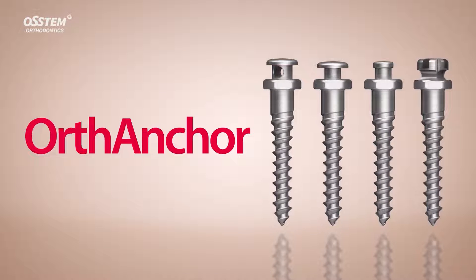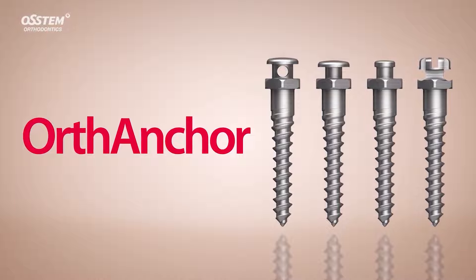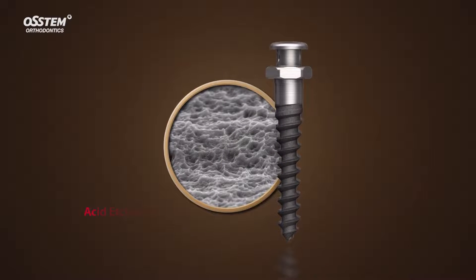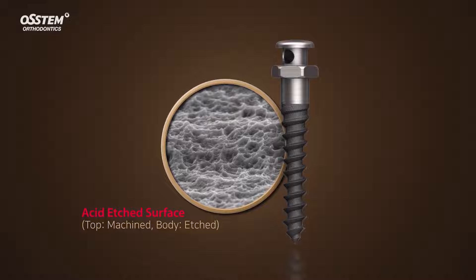Introducing the OrthAnchor. The OrthAnchor is an orthodontic screw made by Austin. It has three notable features. Two different types of OrthAnchors are currently available: a machine surface and an acid etched surface product.